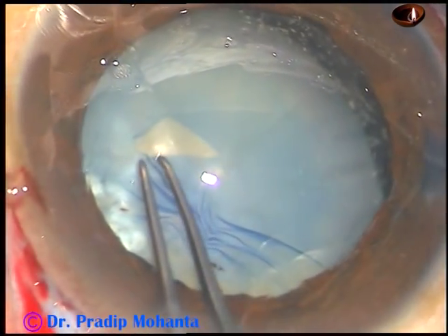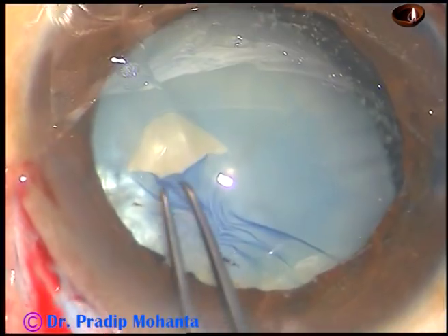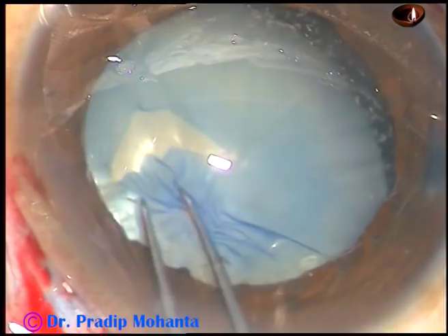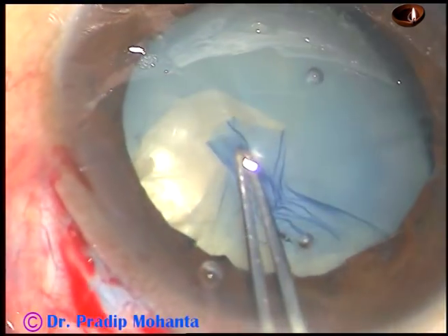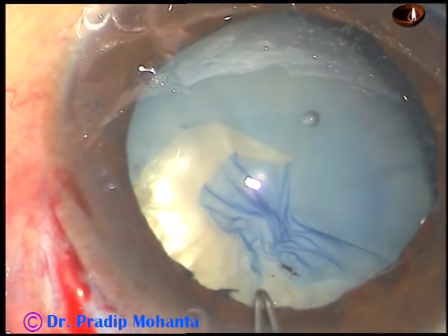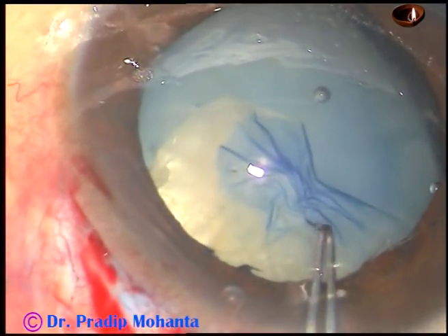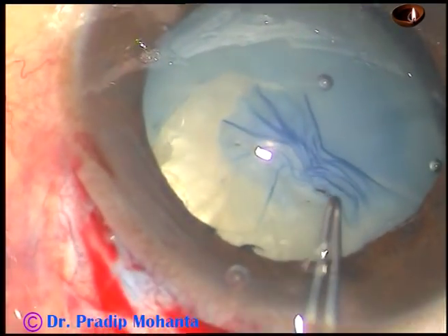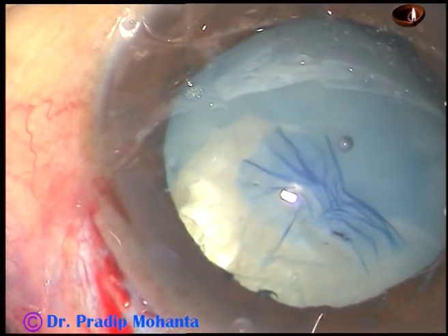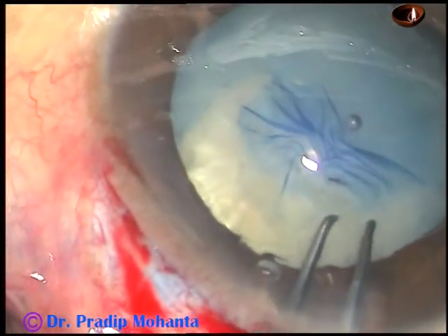The main incision has been made at around 11 o'clock, and now I'm trying to do capsulorhexis. See what happens — the capsule has gone to the far periphery. I've been able to bring it back, but again at around 9 o'clock it goes again to the periphery.